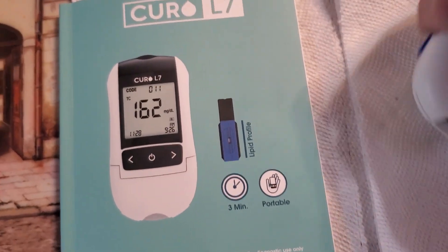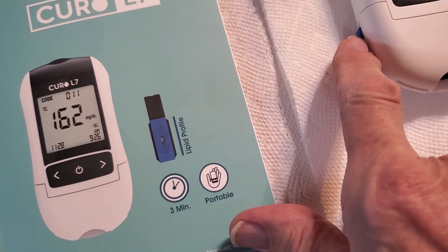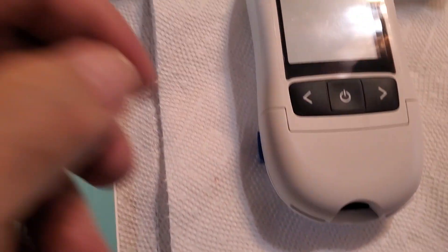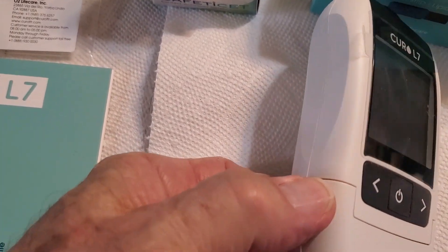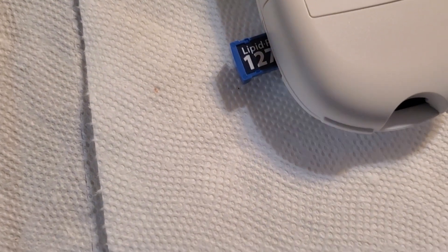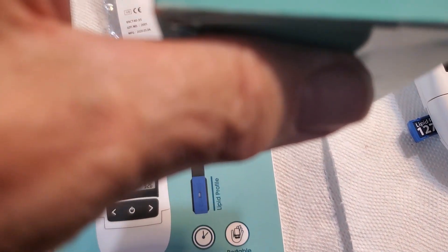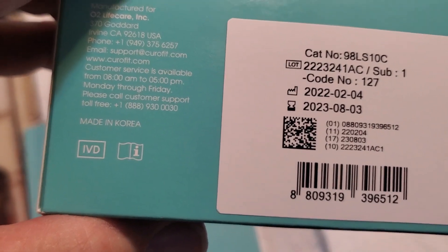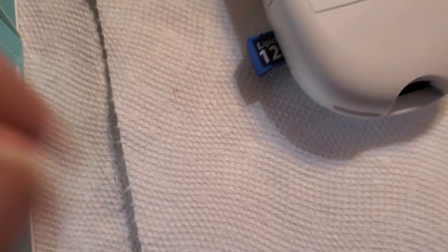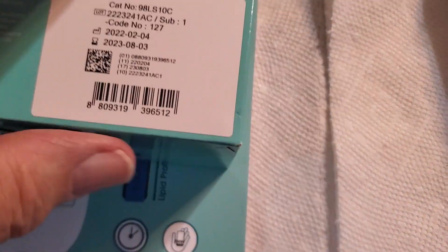Here's the unit itself — there's a door. Here is the chip that goes in there; it just pushes in. The box is supposed to have that same number on it, the code. You see the code? 127, here's 127. Each box comes with its own code and it has to be in there.